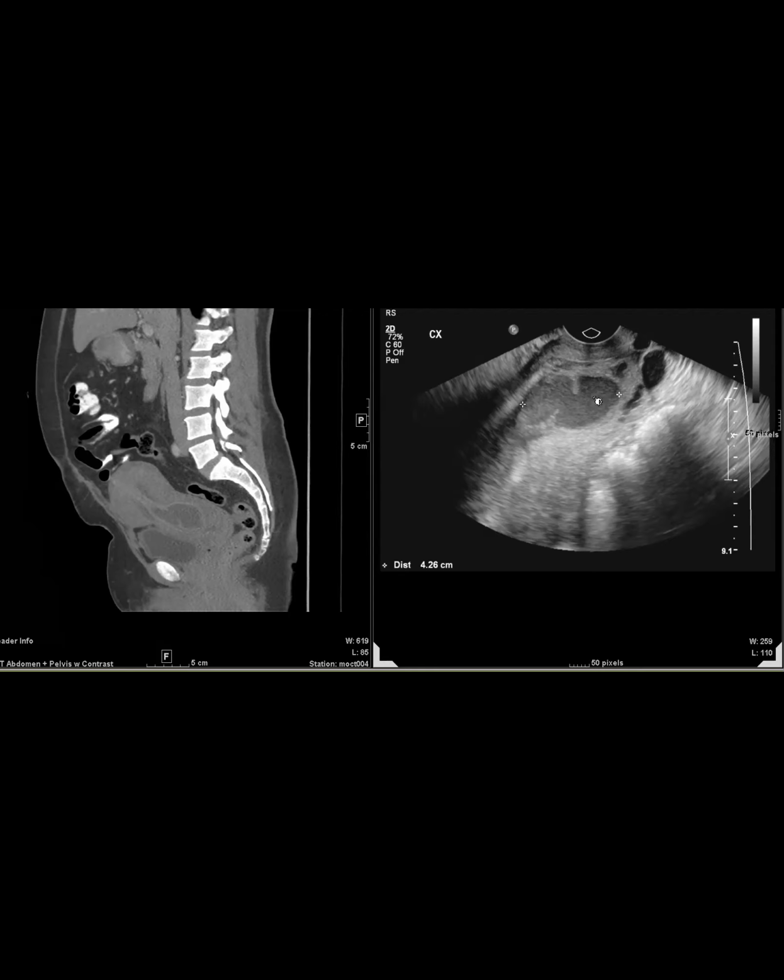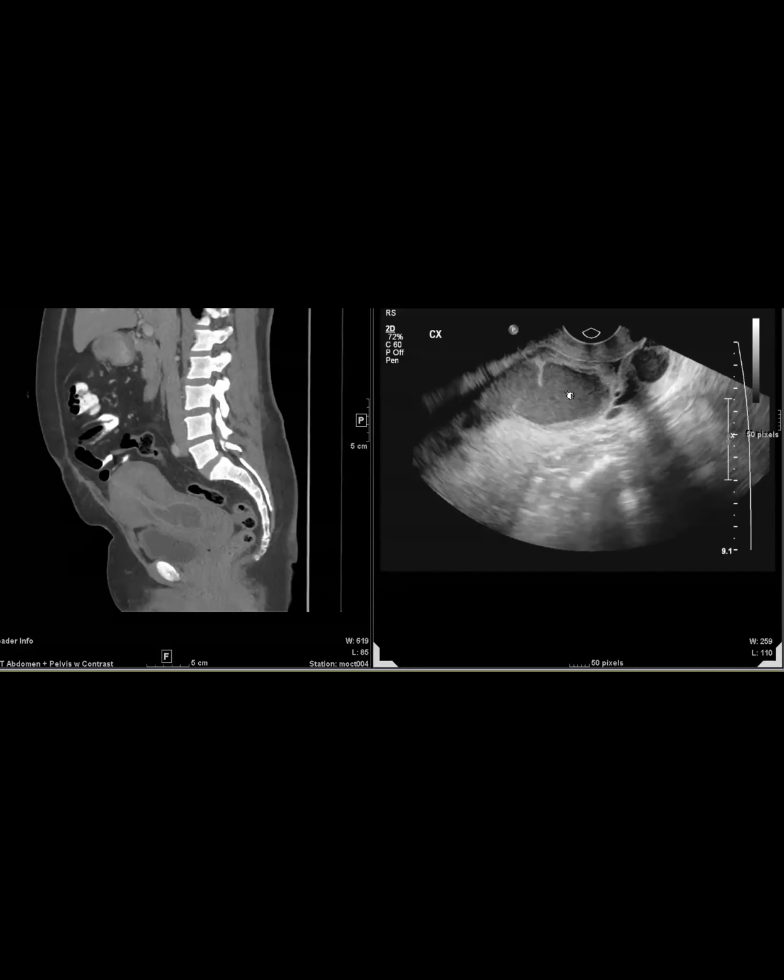And you can see that there are these low-level echoes in the leiomyoma, in this adenomyoma, sorry. So this is probably those hemorrhagic, dilated spaces. In retrospect, I don't think there's anything you can prospectively say other than what we thought, either prolapsing leiomyoma or some sort of necrotic polyp. But it was just a cool thing. There was just unusual path in this patient.